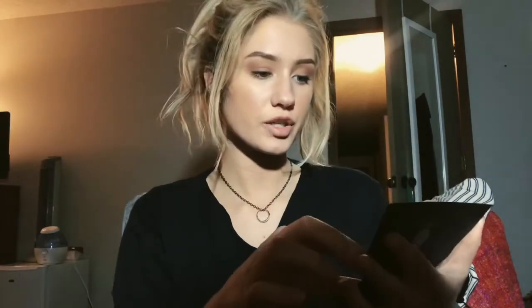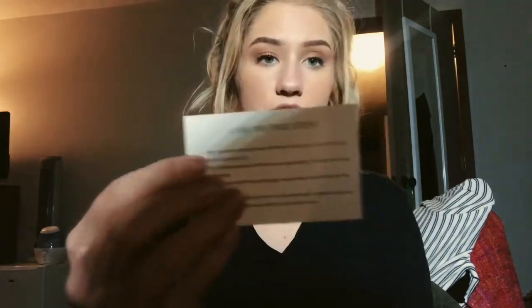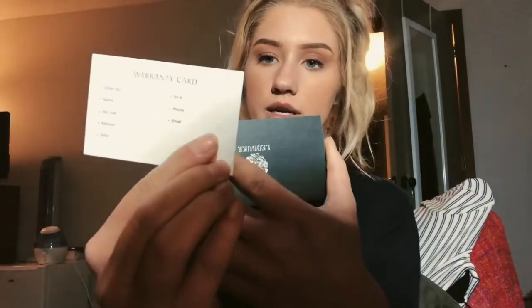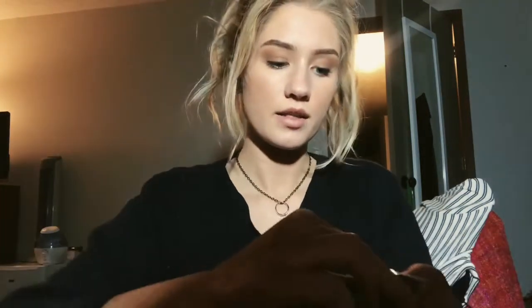Inside the box, there's first this card — it has the return procedure. You can return for a refund or exchange within 30 days. There's also a little care instruction card and a warranty card inside.